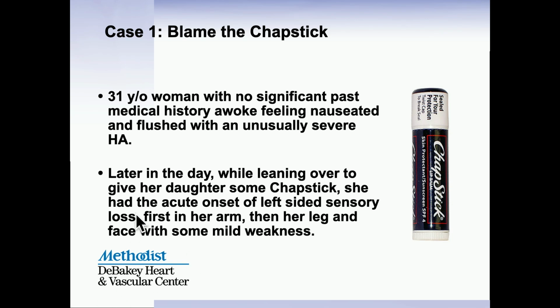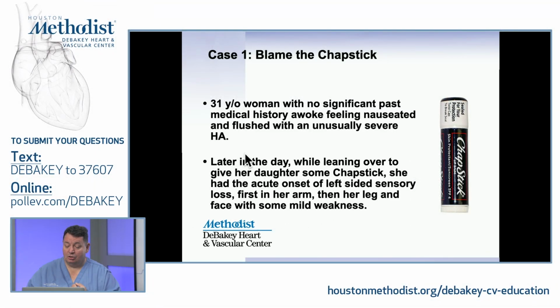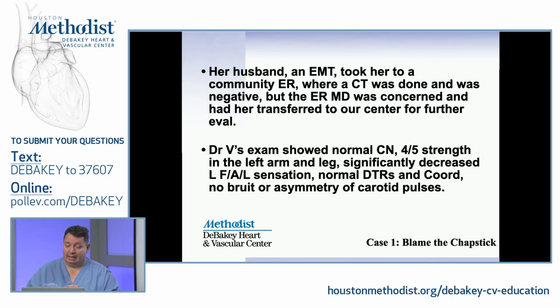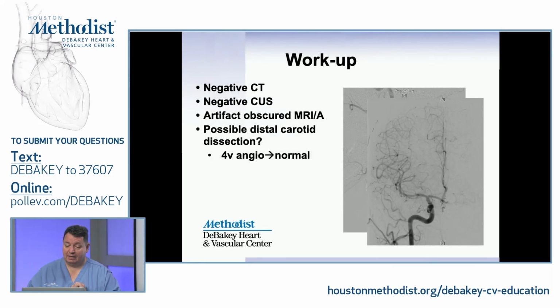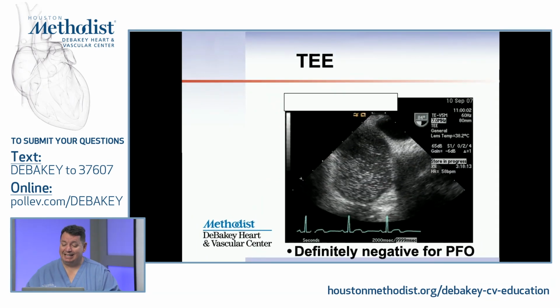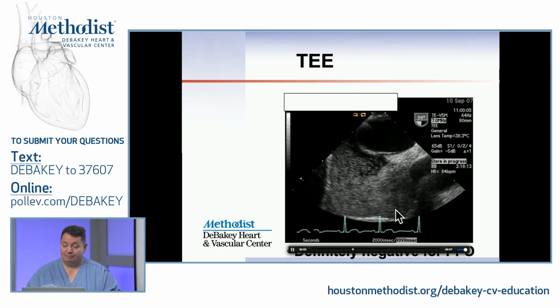And luckily, when she developed the symptoms, the headache and being nauseated, the husband, being a paramedic, immediately called 911. They had, again, CT done. They had everything done as showing negative, negative, negative. But we had a TEE. And this is defined as negative.